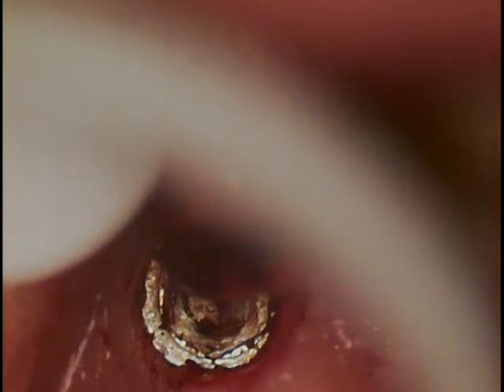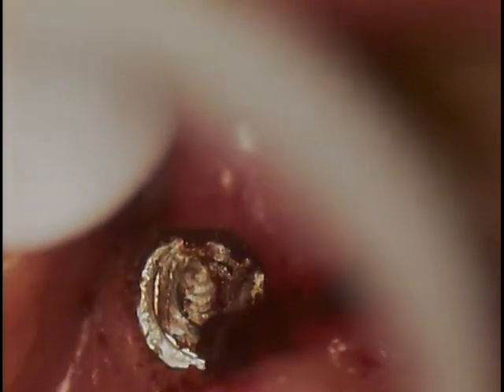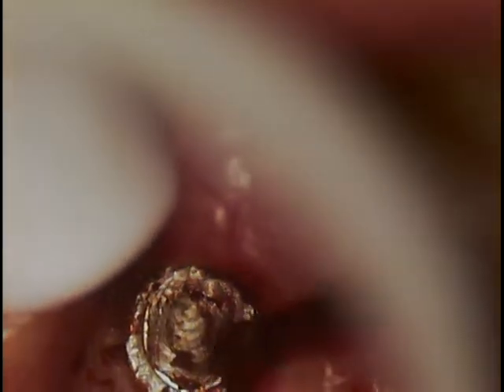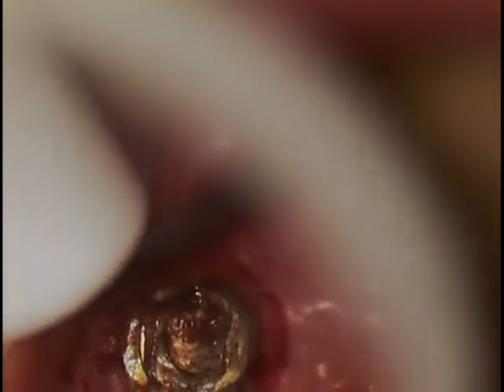We've got a lot of cold welding in there. This is chemical cautery now — I'm just going to get rid of some of the bleeding. We have a situation where it's cold welded and half of the hex is gone. It ran all the way down on the side of the fixture. We can make an attempt to get it out, and if they can salvage it via a non-engaging impression coping, they can probably go with it.